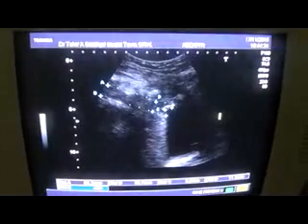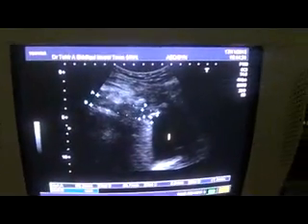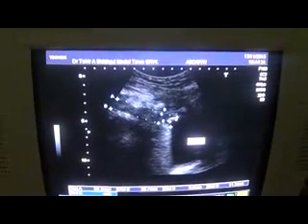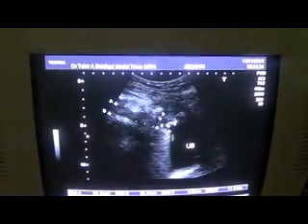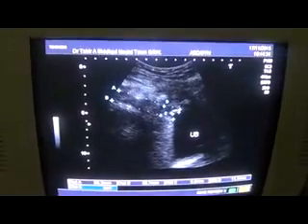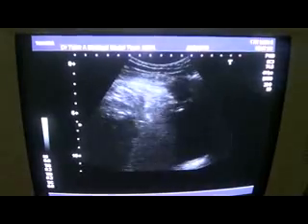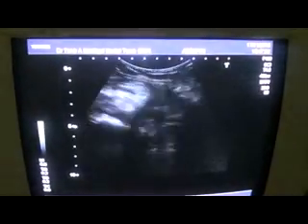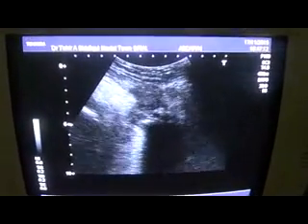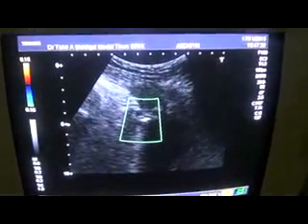So, had there not been any history of surgical intervention, then we would have thought of some fistula or some other pathology. So, this is the urinary bladder, and this is the cause of all of the pathology that we have seen relating to the right kidney. Now let's see if there is any blood flow within it, or am I making a mistake? When you have the facility of a Doppler, it should be applied. Now I'm going to apply the Doppler to see if there is any flow within it.